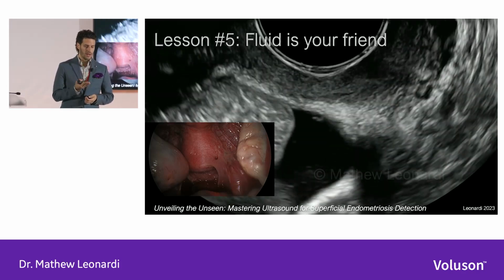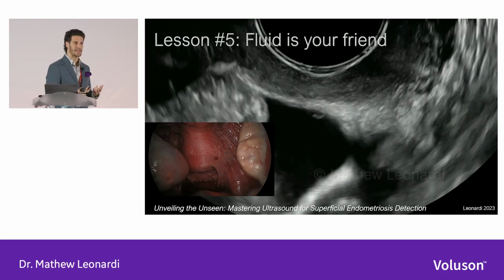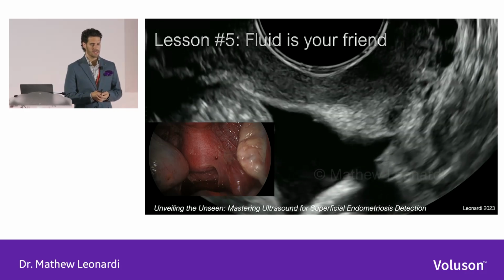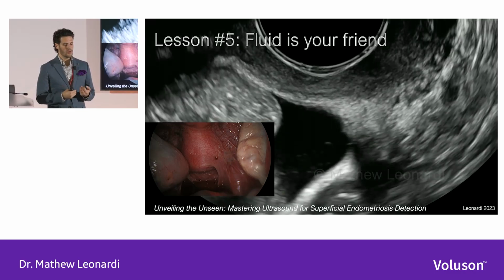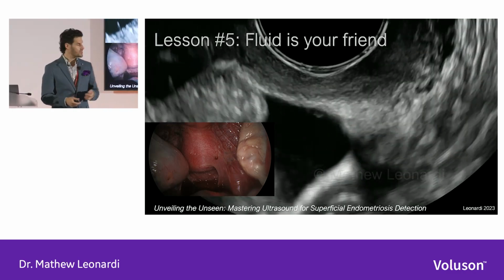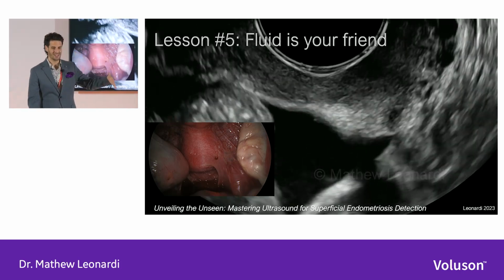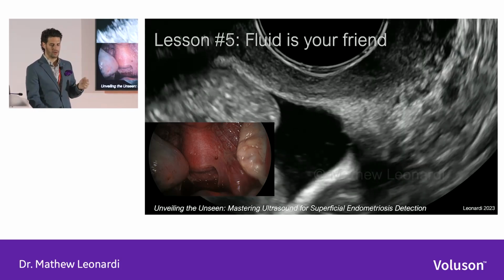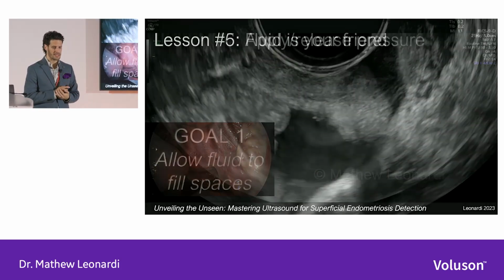You can see the surgical depiction of that superficial endometriosis. You can see it's flame red. It is hanging off of that uterosacral ligament. And so this is a comparison of the two. When there's no fluid there, that small bowel that's just kind of hovering, right here you can see sort of the peristalsis, that's just going to be settling in that space and you're not going to really see these very subtle features. So when there is fluid there, pay attention.